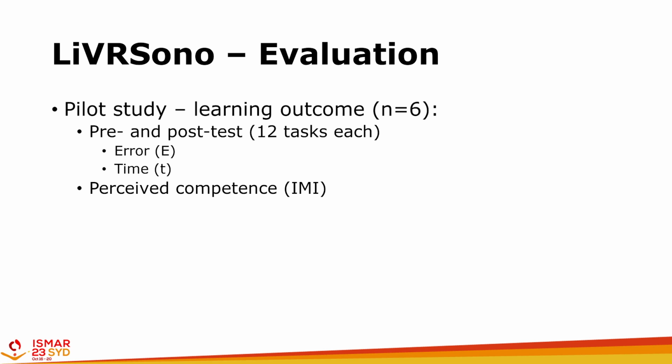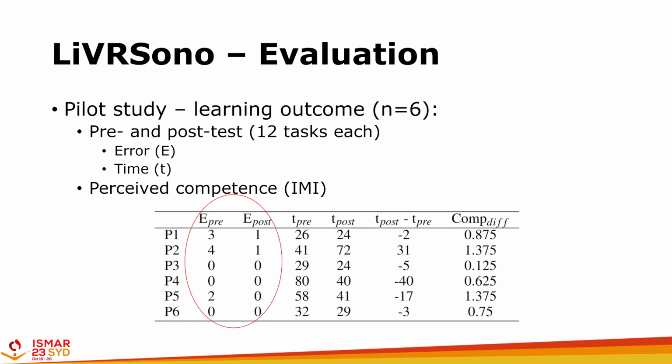Additionally, we conducted a small pilot study regarding learning outcome. Therefore, we had 6 non-medical participants, and this limited number was because we want to reserve the target group. They had 3 training sessions with 4 tasks of training scenario 3, so the one with the liver model which was rated best and does not require medical knowledge. In a pre and a post test, we recorded errors and time per task, and each of the tests consists of 12 tasks. And we also used the competence item of the intrinsic motivation inventory.